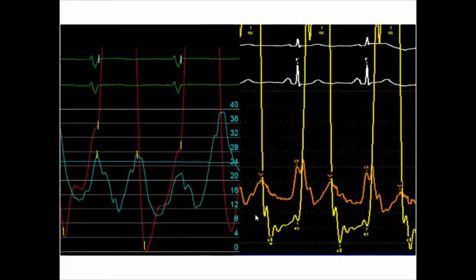And here in the atrial pressure or pulmonary capillary wedge pressure, you can already see the A and V waves. So this is the pulmonary capillary wedge pressure or left atrial pressure, because they resemble each other. So what is the finding in general, without specification? We have a diastolic gradient also. If we have a diastolic gradient between the LV and the pulmonary capillary wedge pressure or left atrium, this indicates a diagnosis of mitral stenosis.